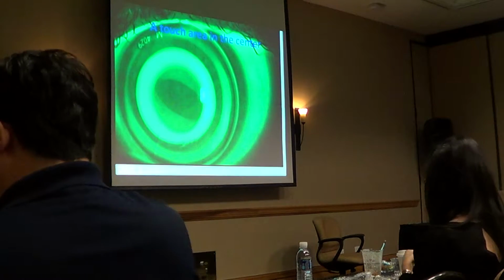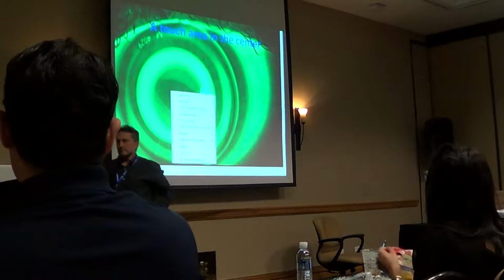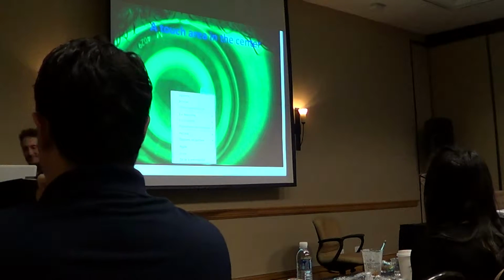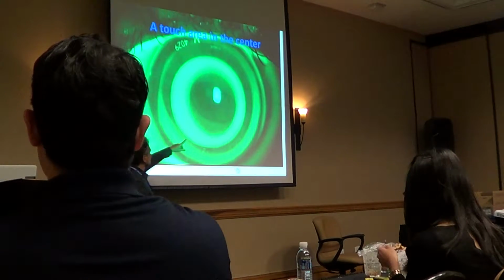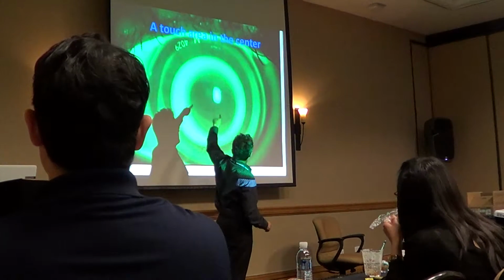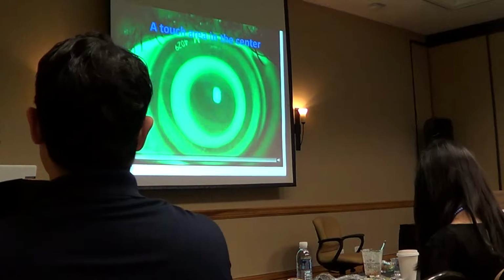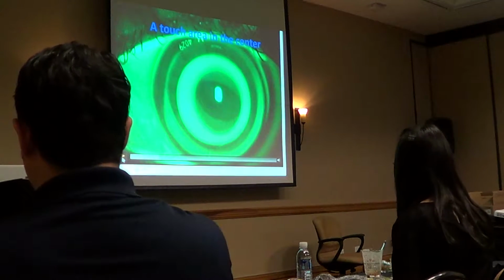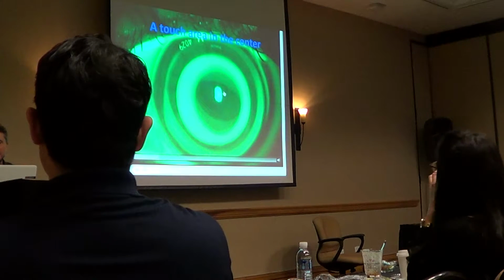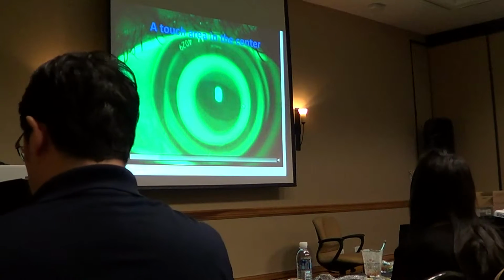Okay, you see the zone? It is not just after the blink. Okay? After the blink, you should look at this area, the oval area, for a toric cornea.